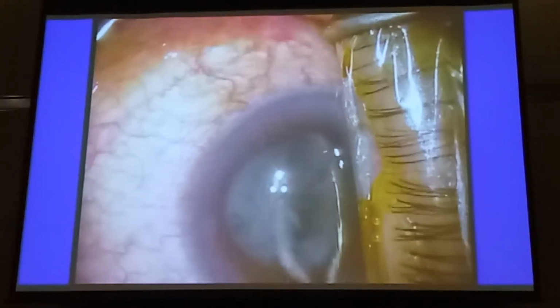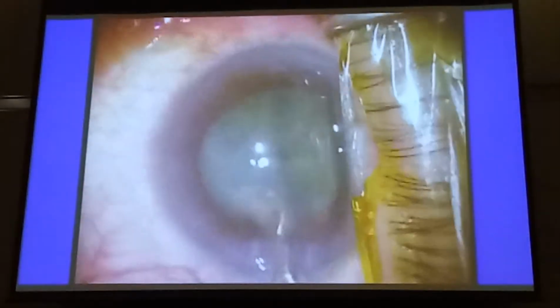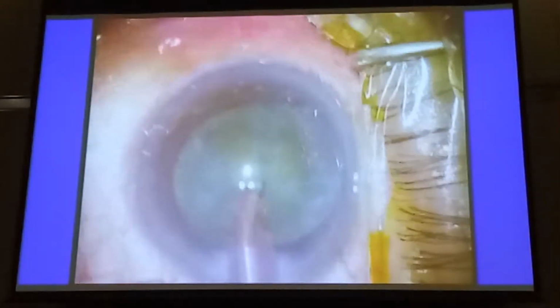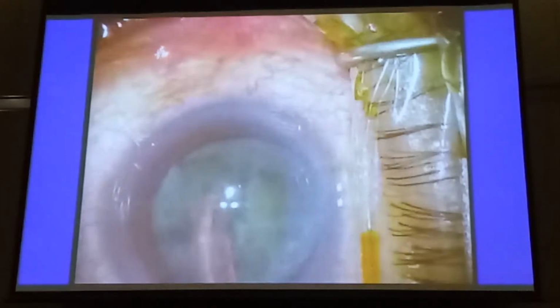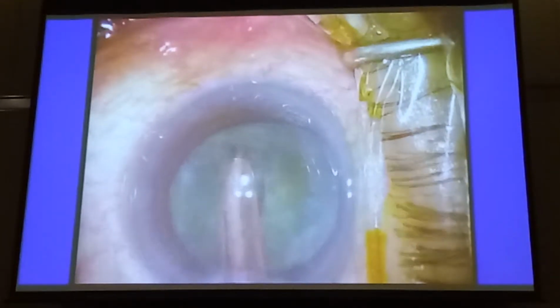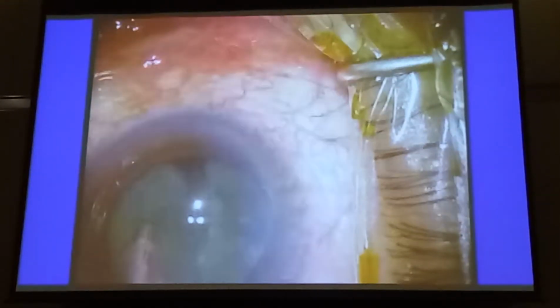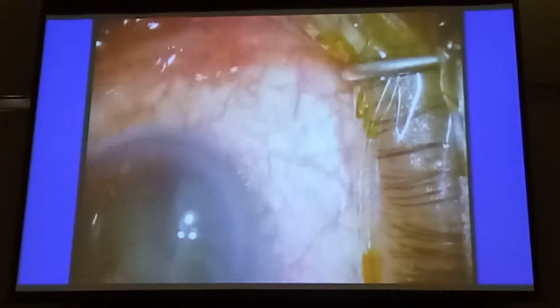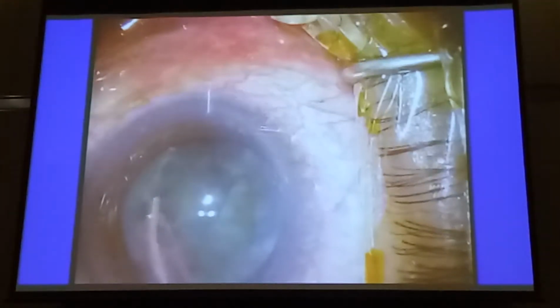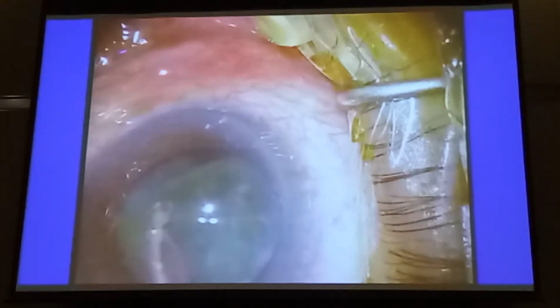Okay, and once you've got it into 4 pieces like this, you don't really need to put in a splitter in the other hand, and you can go ahead and do the phaco. As you can see here, just go straight ahead, impale that quadrant, and go to memory 2 where the vacuum is high, so you can pull the nuclear fragment out. You can see here it's a little bit sticky, but eventually it will come out. You just need to get the grip, and then the fragment will come.